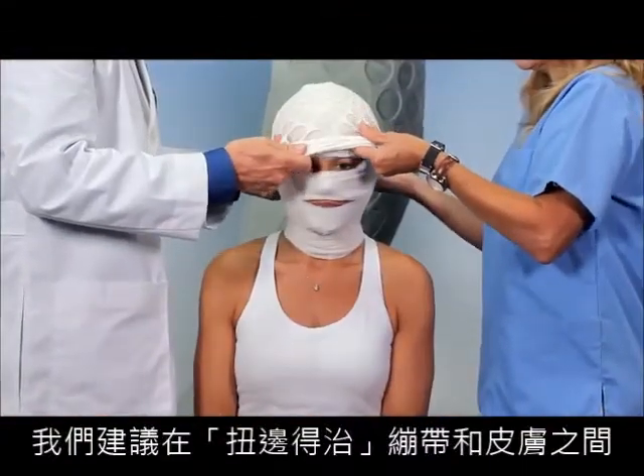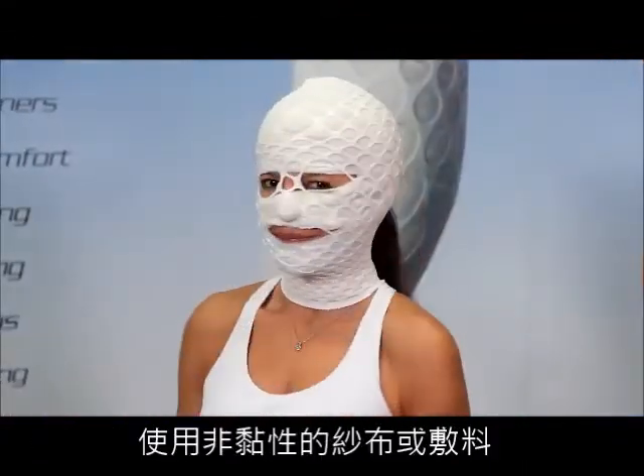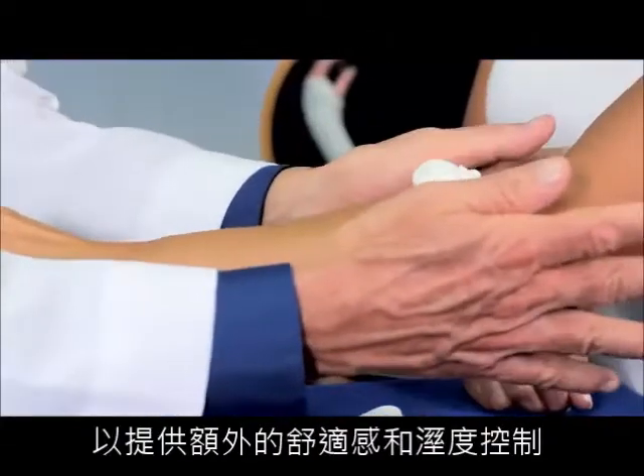We always recommend to use a non-adherent cotton dressing between the New Bandage and the skin for additional comfort and moisture control.